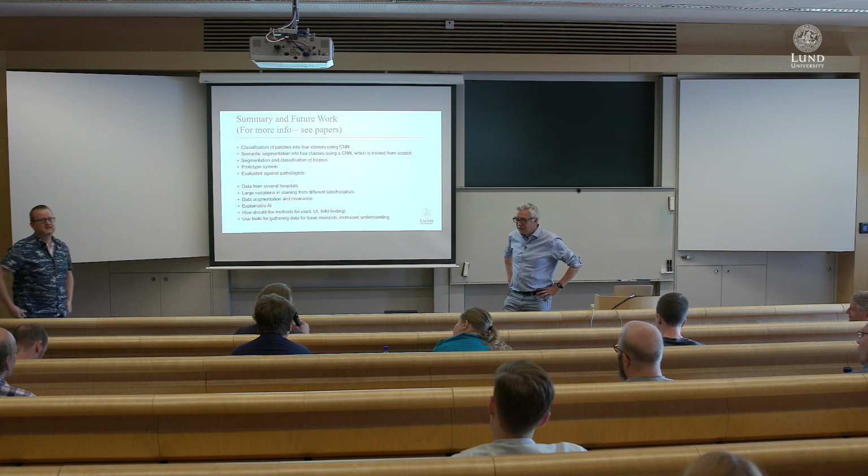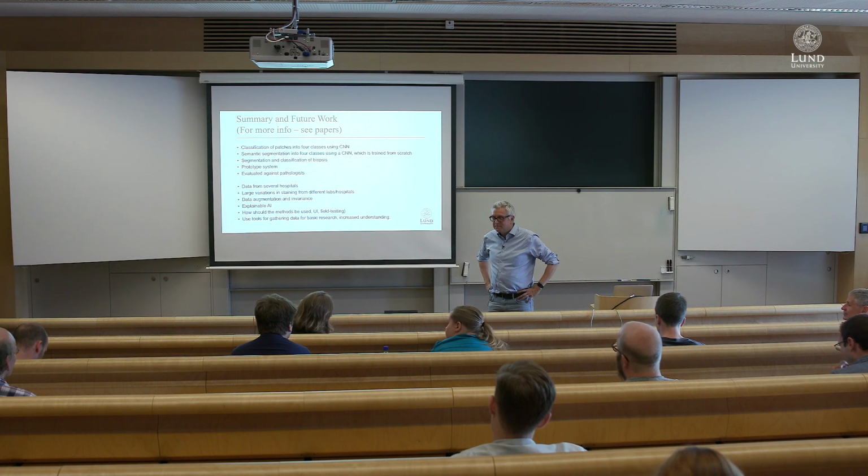Very impressive work. Thanks a lot. I was just thinking, you have two data sets from two hospitals, two sets of pictures. So if they can be somehow digitized, so quantified somehow, you have two matrices, X and Y. So you can sort of extract a common variation from these two matrices, or calculate a covariance matrix of X and Y, and factorize this common variation. So those factors will be your common features, because you want to extract common features and train your classifier on the common features, right? Yeah.